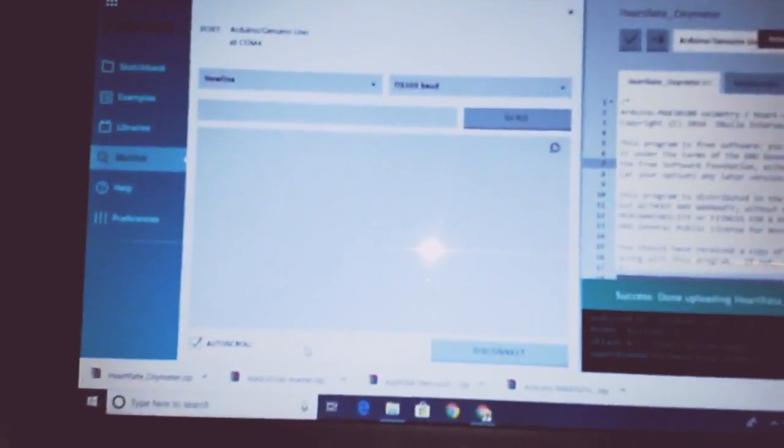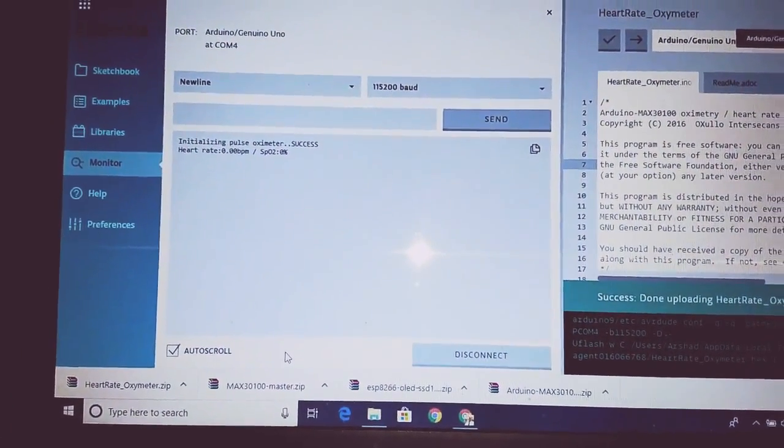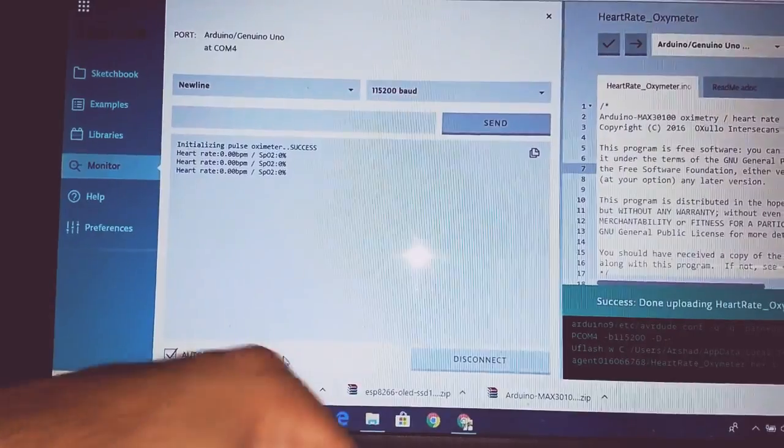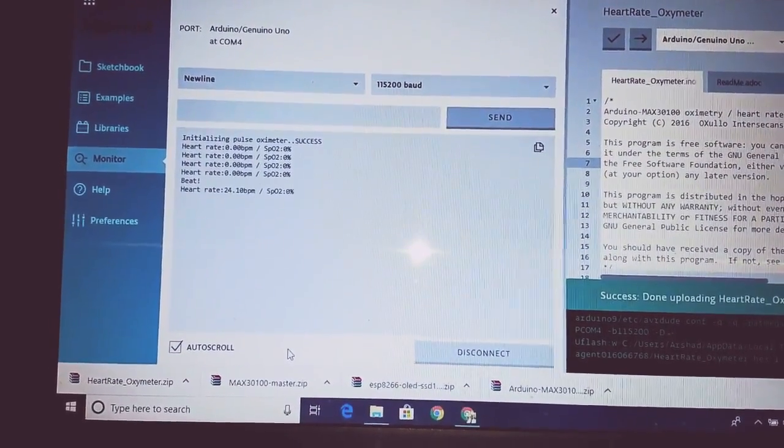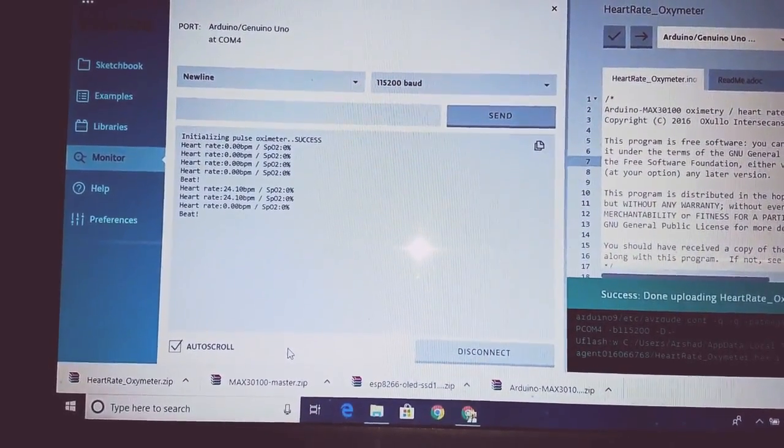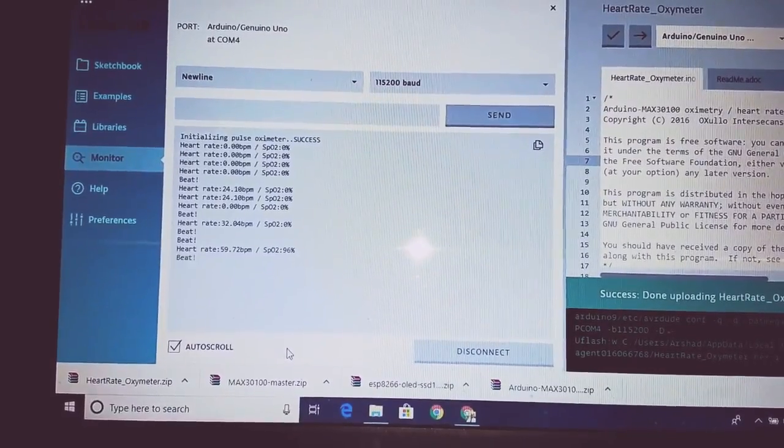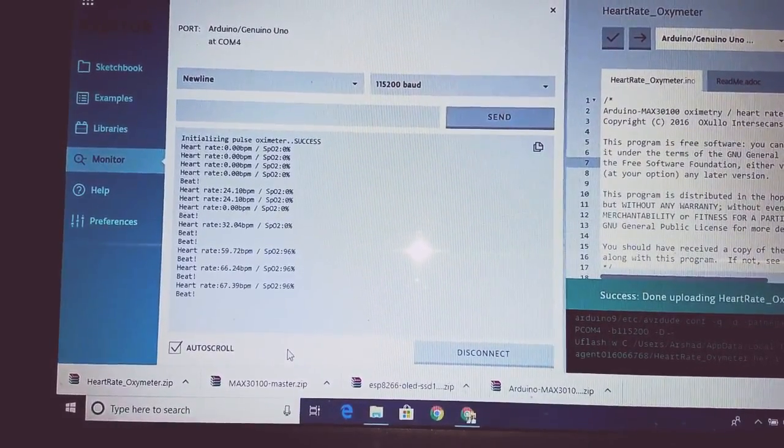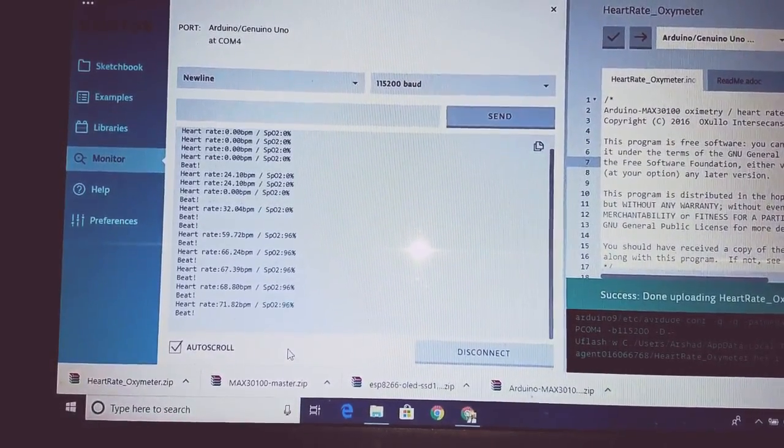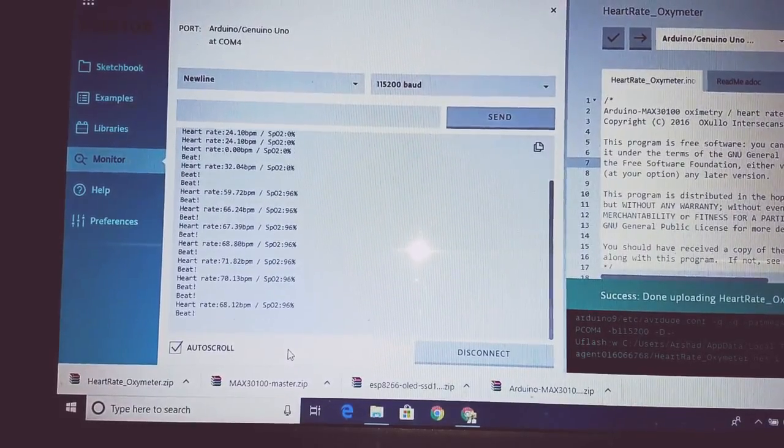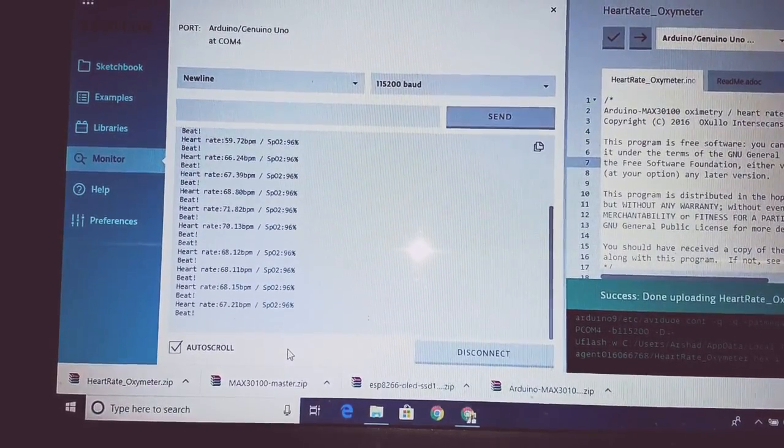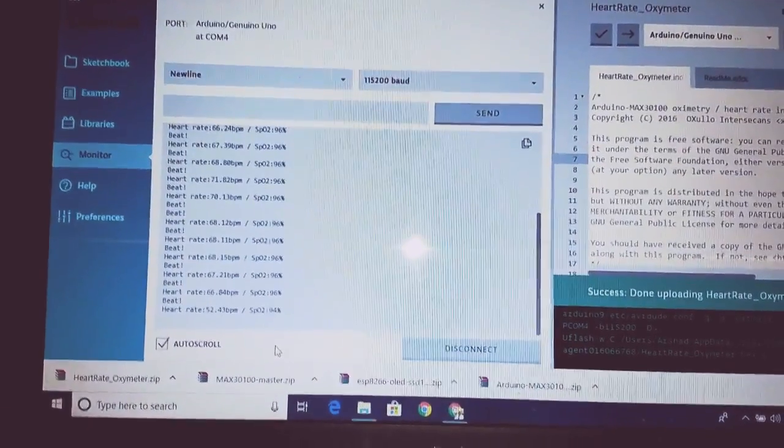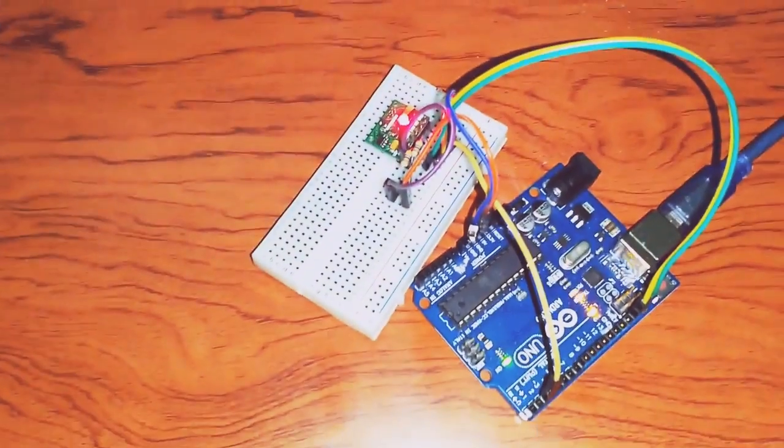Here's the serial monitor. I'll put my finger on the sensor - you have to stay super still and wait for a few seconds. So it's around 60 beats, 68, and 96 percent oxygen saturation. Thank you very much.